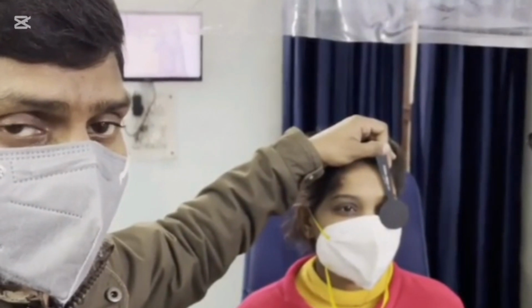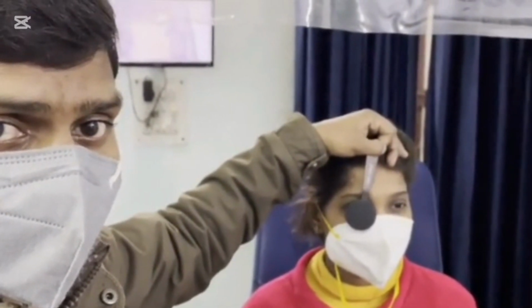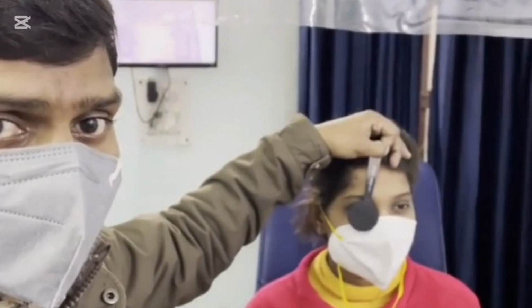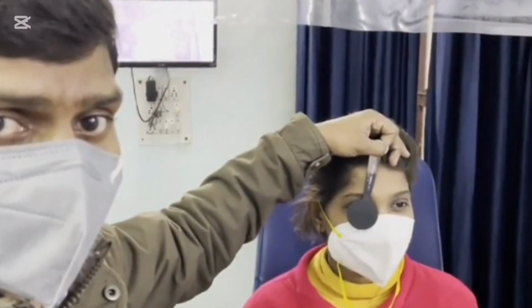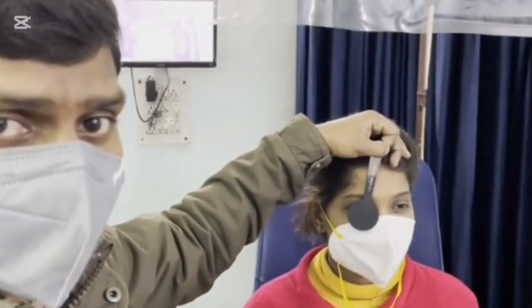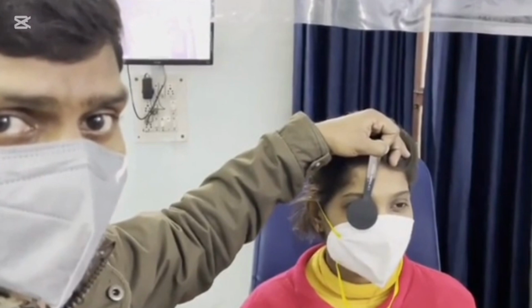The patient is asked to read the chart with each eye separately and the visual acuity is recorded as a fraction, the numerator being the distance of the patient from the letters and the denominator being the smallest letters accurately read. When the patient is able to read up to 6 meter line, the visual acuity is recorded as 6 by 6, which is normal.